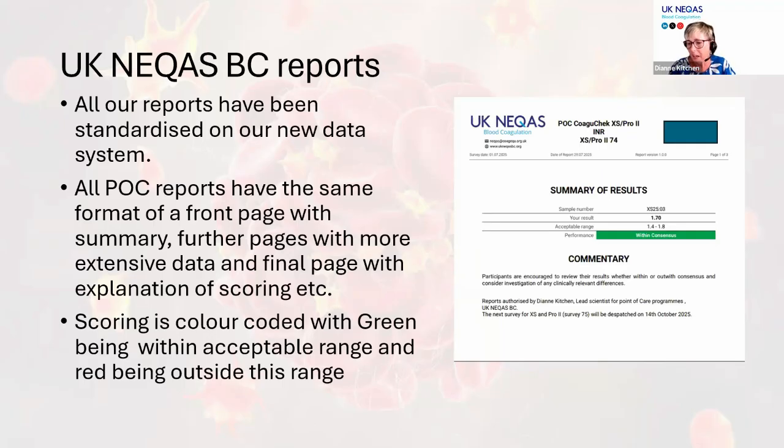But on the front page, we have the code of the device, the result, the acceptable range and how you did, and in this case within consensus. We have who signed off on this report and when the next survey is due, so you should always know when the next survey is coming.